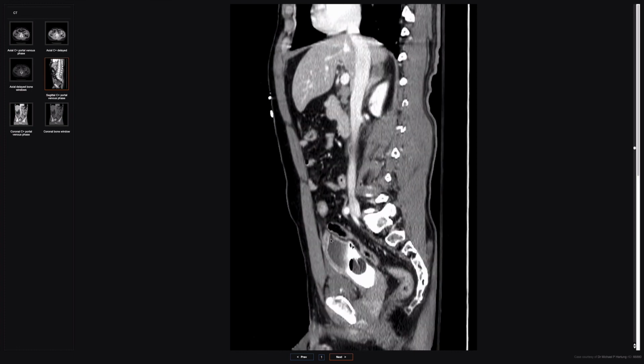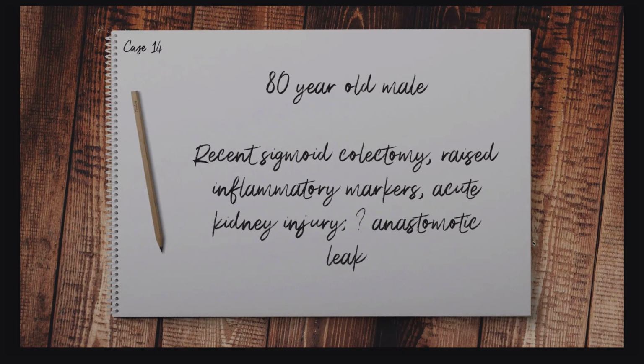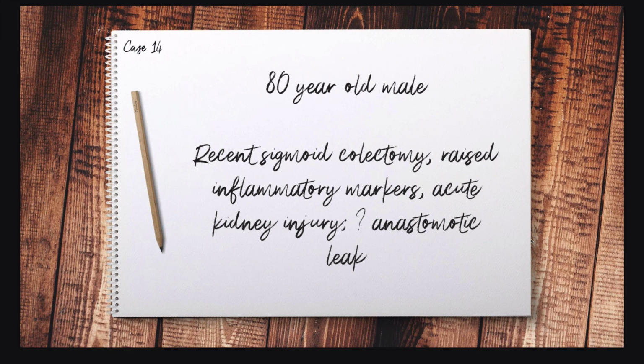Now, very broadly speaking, the ones that require operative management are these ones, the intraperitoneal bladder ruptures. The other ones, the extraperitoneal ruptures, are treated usually with a conservative pathway with catheterization. Okay, and then finally, the final kind of route of administration of contrast is rectally or anally. And this is the one we do least often, but here's an example if you ever need to do it.